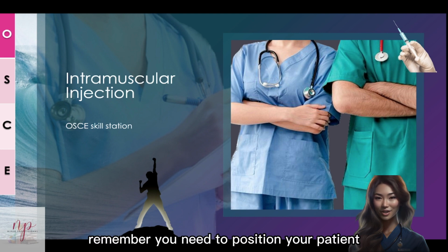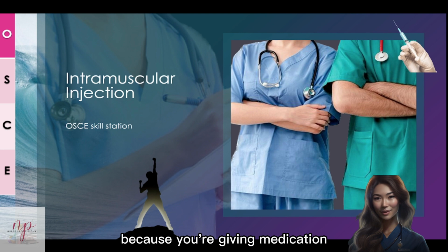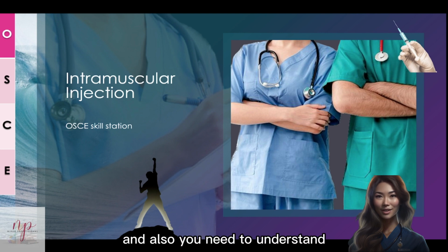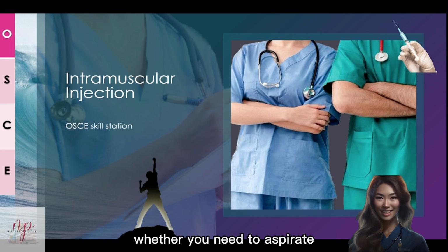Remember, you need to position your patients, and also check the 5 rights because you are giving medication. And also you need to understand all the steps for giving the intramuscular injection, whether you need to aspirate, and what steps you need to do when you are preparing to inject.